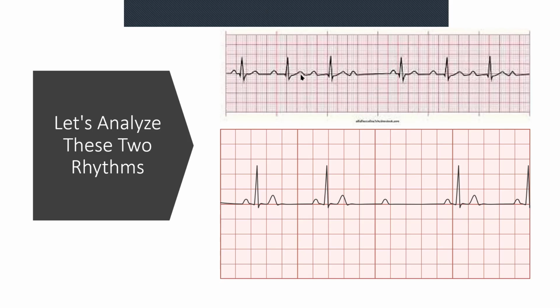What you do with a Mobitz type 1, you would refer. It depends on the symptoms as well. So if the patient is severely ill, of course, then that could be the cause. But there's lots of reasons why. I'm just trying to give you, because it's nice to see it, but what do you do with it?